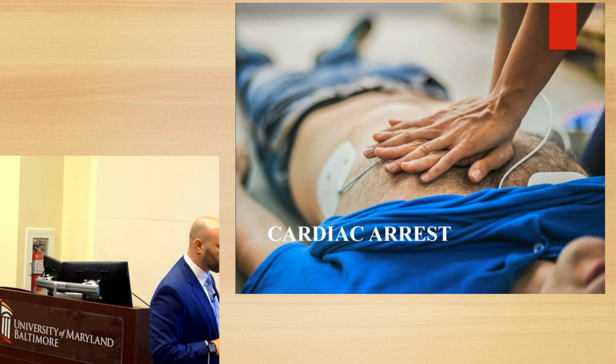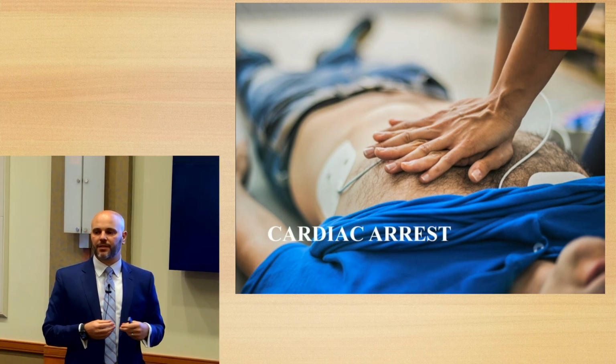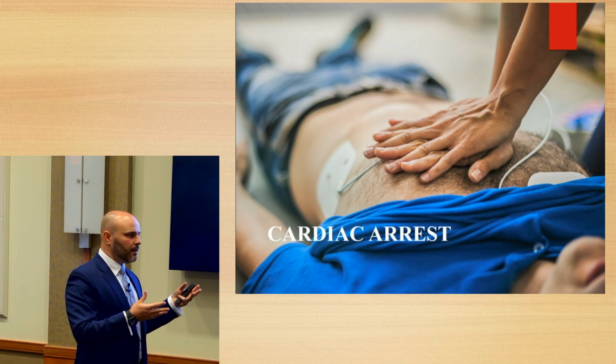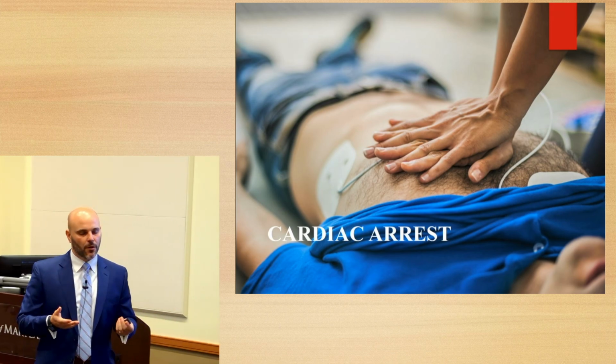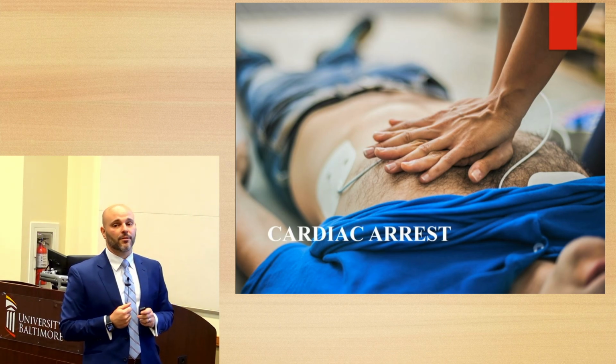Now with cardiac arrest. Going back to the journey of the CO2 slide, it is vital that the end-tidal is determined by the cardiac output. So if the cardiac output is dysfunctional or you don't have a perfusing rhythm, your end-tidal is going to fall off.